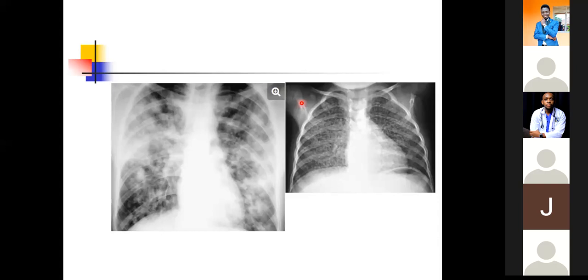I see sometimes patients who have that typical ground glass appearance on CT scan, whether it's contrast or non-contrast, and you may not necessarily be able to see it as typical on an X-ray. And my question is, why could it be so?